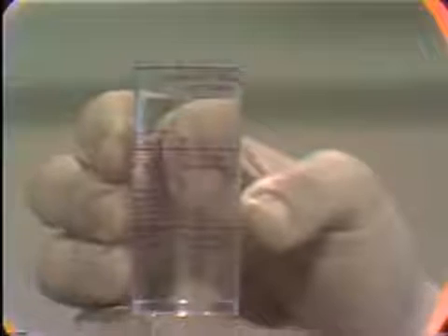When securing a preliminary impression in alginate of an edentulous mouth, it is advantageous to use slightly warmer water and in less amount than we would normally use for dentate patients. The differences in the water temperature and water powder ratio will result in a stiffer mix that will set faster. The stiff material will better record the peripheries and soft tissue anatomical landmarks necessary for the impression.